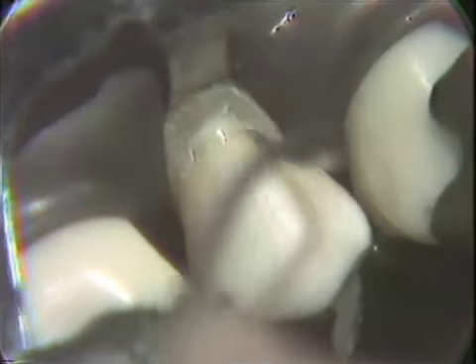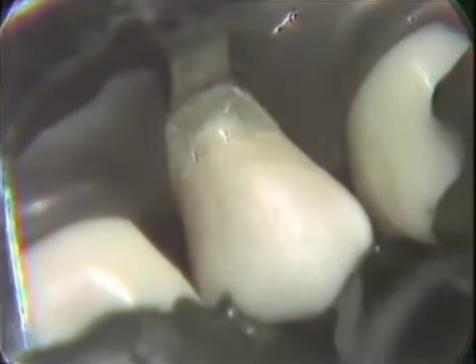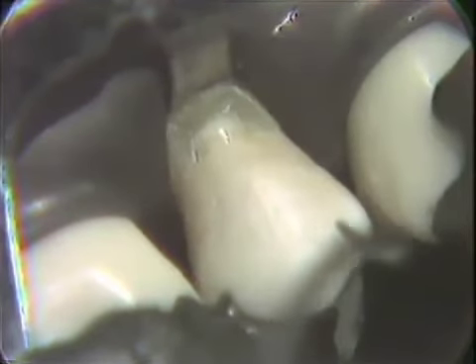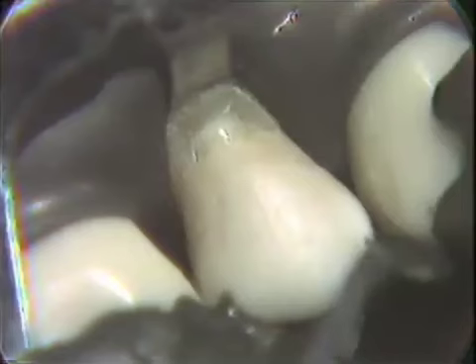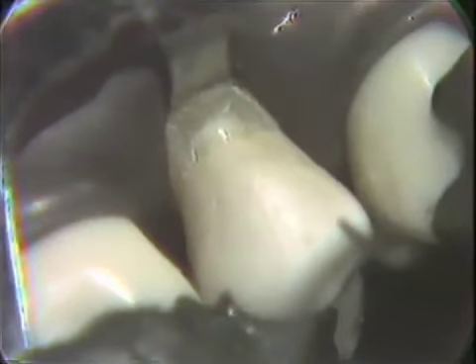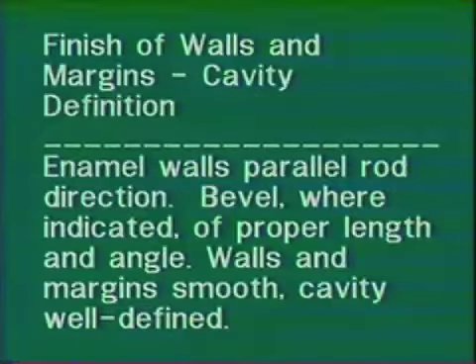I think it's well here too to notice the position of that gingival retractor, the rubber dam clamp, the 212 clamp, in relation to the gingival margin of the preparation. There is that half millimeter space, or half millimeter plus, that's necessary in order to have access to the condensation of this margin. And obviously it's the ability to gain this type of isolation that permits us to do the Class 5 cohesive gold. Now let's look at the criteria that we have for the preparation.